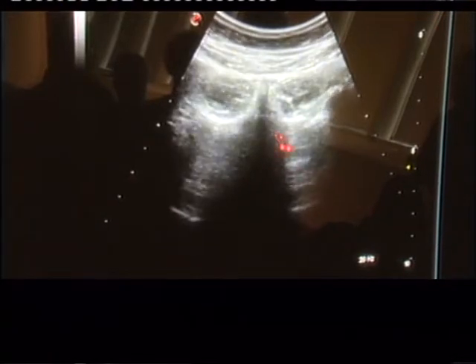Now I have the lumbar vertebra. Now we have S1. The first, S1. And sacroiliac, let's go over. Very well. Now I'll show you something else. If you want to see the SI joint, you see ilium, joint. Okay, right there.